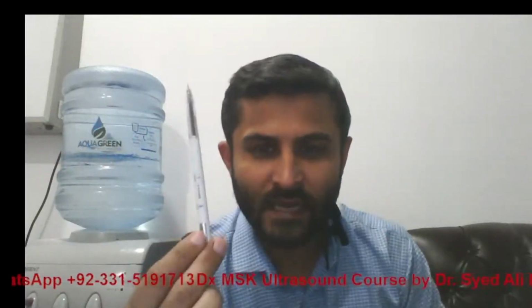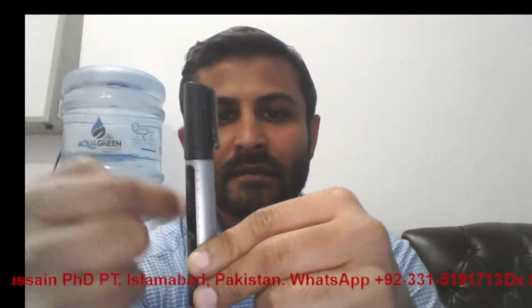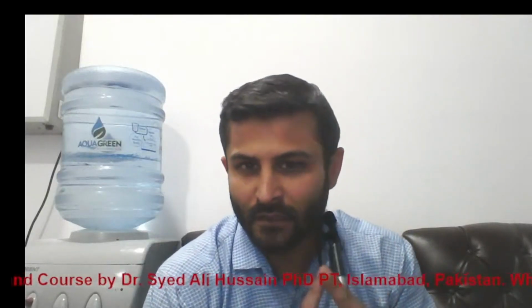So I'm going to ask you a simple question. Let's consider that this is a pen, a marker. If we want to scan this, what is the short axis? Of course, if you place the probe like this, it's short axis. And if you place the probe like this, it is long axis. So long axis can be from the front, from the right side, or from the left side, depending. But short axis can be from any side and it will have a similar cross-section area. So for tendons, it is 90-degree or perpendicular scanning.